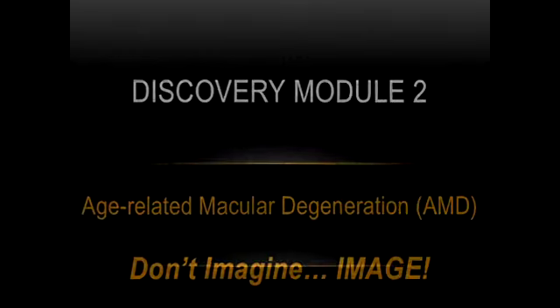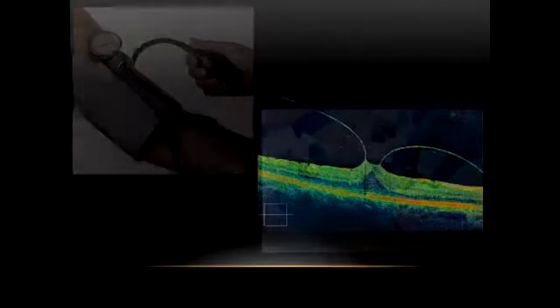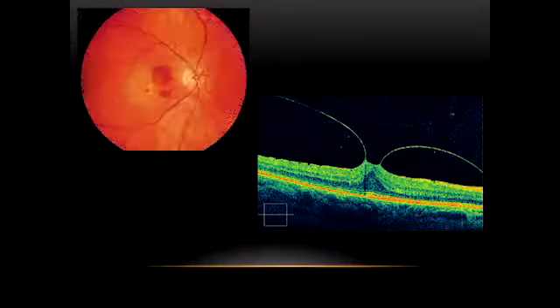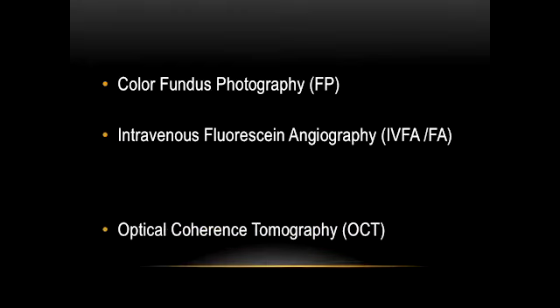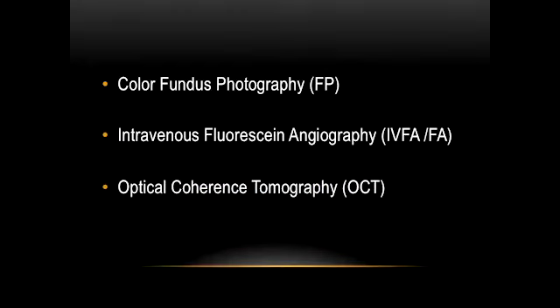Hello again. Most medical specialties rely on objective data, like blood pressure and numbers from blood tests. Well, retina is very different in that it's highly image-driven and therefore quite subjective. Trending patterns in thickness, contours, and colors is critically important in retinal care. So standard in-office testing includes color fundus photography, fluorescein angiography, and an incredibly useful tool called optical coherence tomography. And you'll hear this abbreviated as OCT.